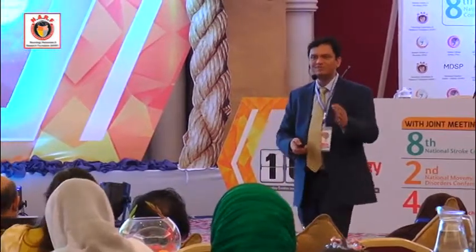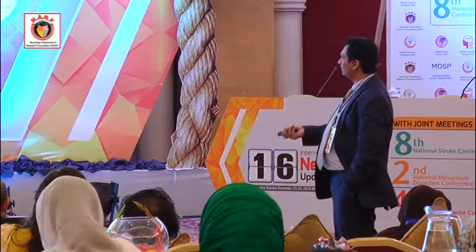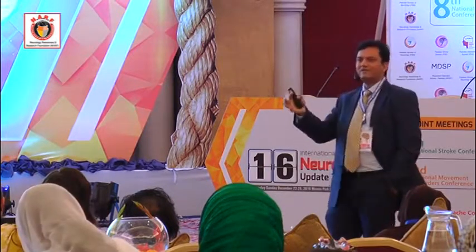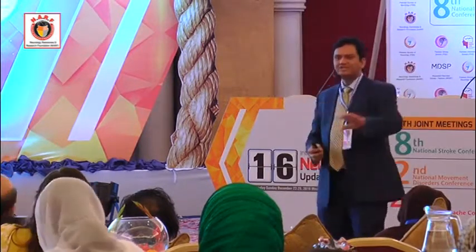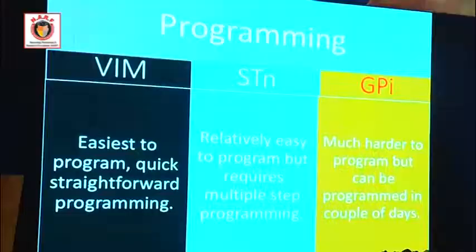Intraoperative mapping is harder, and intraoperative stimulation is much, much harder, and the speakers after me will explain that to you better. Programming is very, very different. VIM is the easiest programming. In a few hours you can learn the programming of VIM, while STN is relatively easy, much harder, but still relatively easy. There are not too many complex algorithms, but it needs frequent visits.